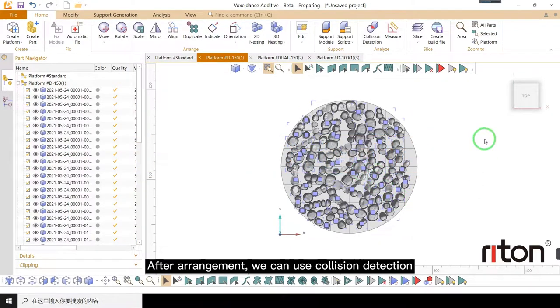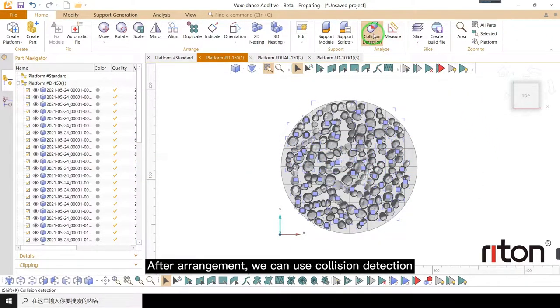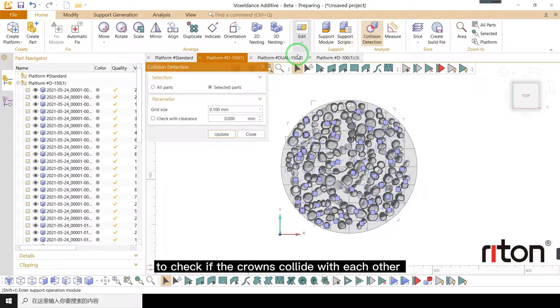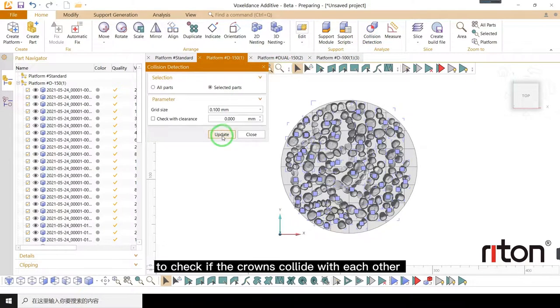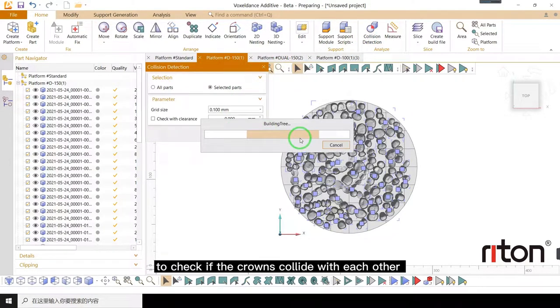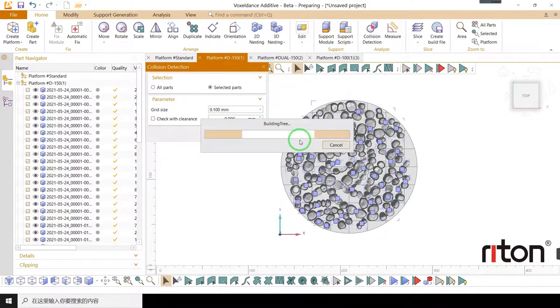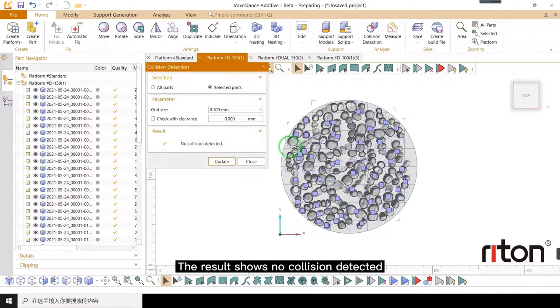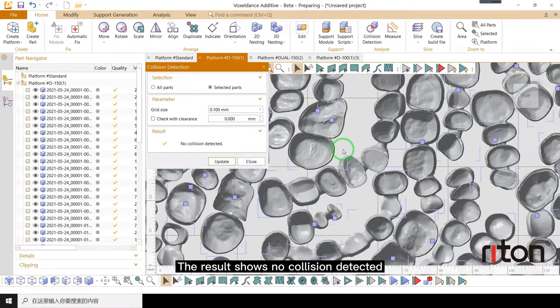After arrangement, we can use collision detection to check if the crowns collide with each other. The result shows no collision detected.